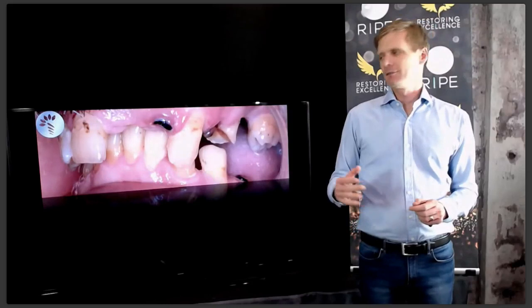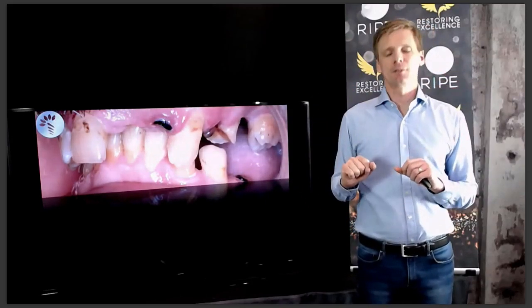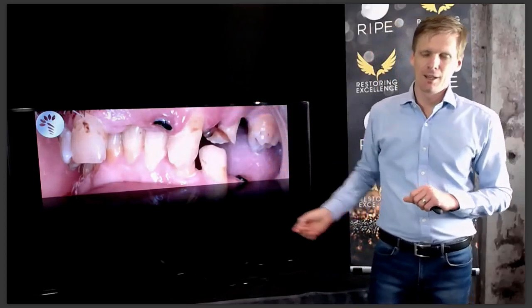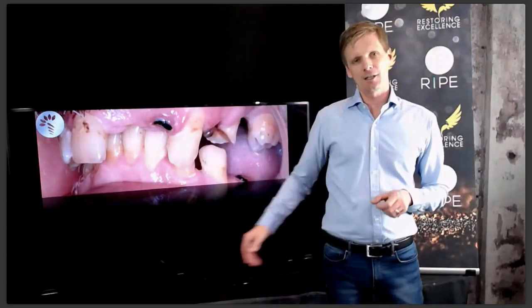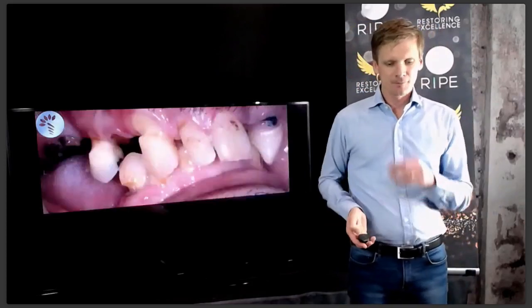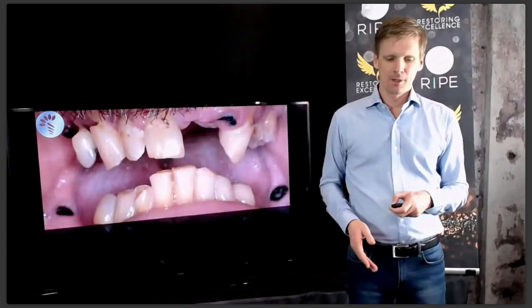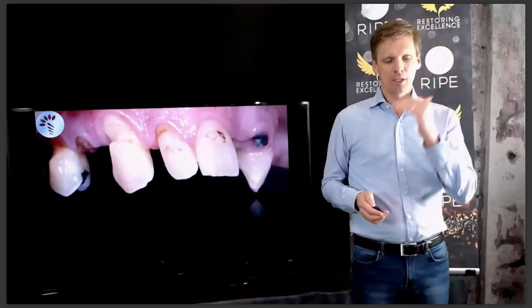When you take the retracted photos, it's very important that the patient's head is not tilted back or forward, because if their head is tilted back, the curve of the upper teeth looks like a frown. And if you planned on that, you would make the front teeth massively long like a duck, okay? It would not be duck face, it would be duck teeth. If a duck had teeth, that's what it would look like. So, lots of issues, okay?